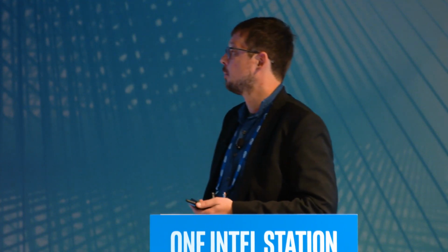But what we wanted to do, so most researchers see this big image, and then of course they think, okay, we have to use GPUs. GPUs are extremely memory constrained, so then we patch this huge image into patches of 224 by 224 pixels, like our ImageNet models are used to, and then we just estimate the amount of tumors in each of these patches, and then we do an aggregate prediction. But we thought, since we're not bound to GPUs, why not use CPU-based systems that have loads of memory? That's the whole motivation of this research.